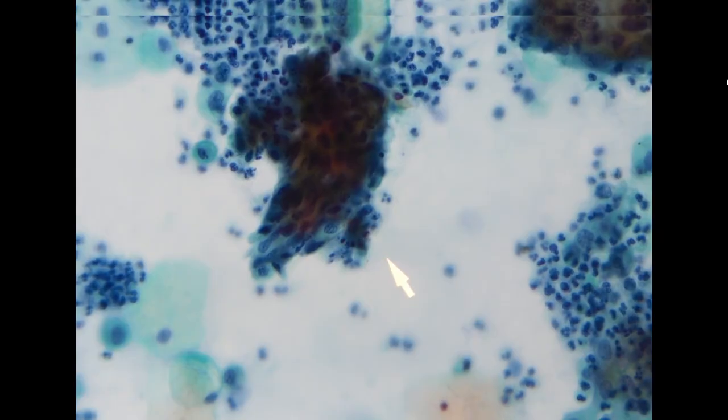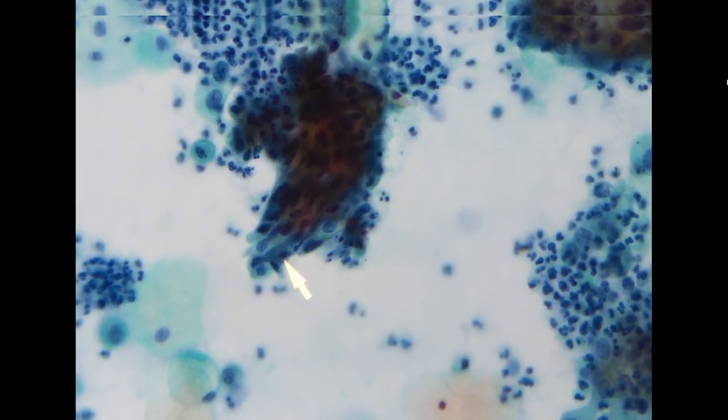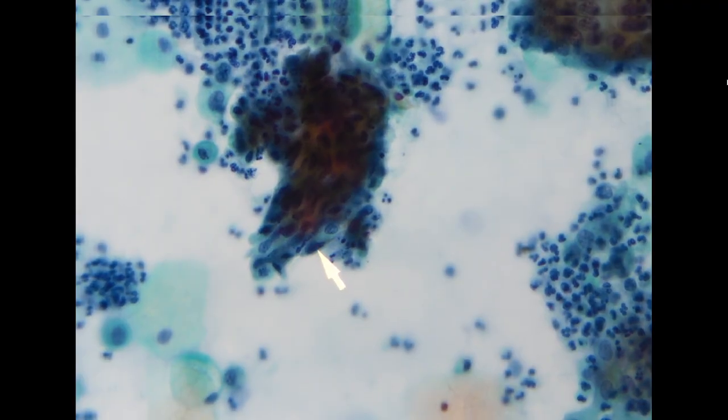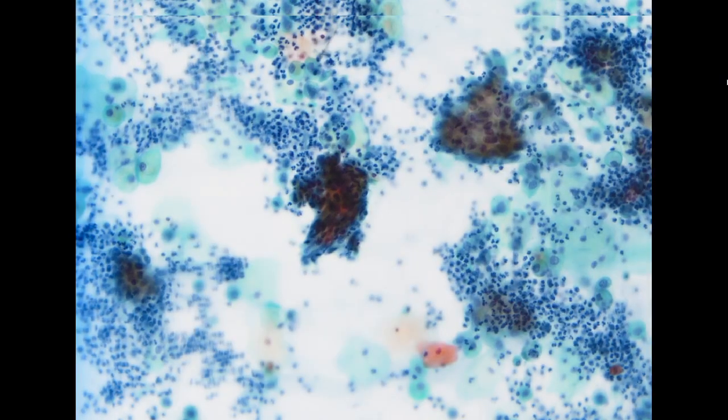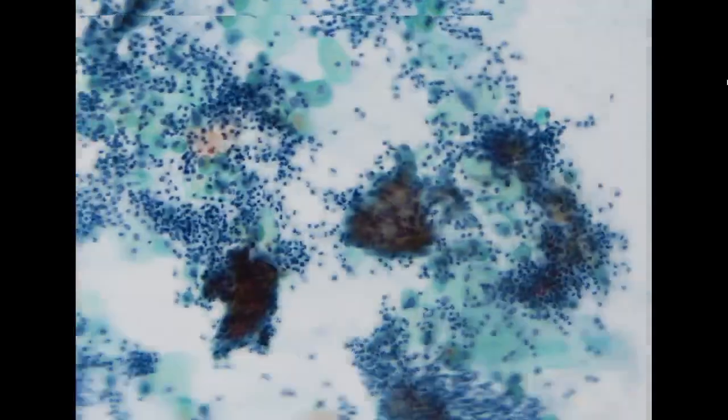For this specimen, we only have these two clusters of cells that are more spindly, with degeneration and pyknotic type nuclear change, but very dark. The NC ratio is increased and they are a little bit spindly. So for this case, we will use ASC-H for these two clusters. This is how we are going to sign out the case. So this is our ASC-H.